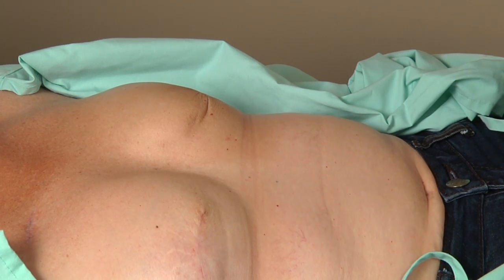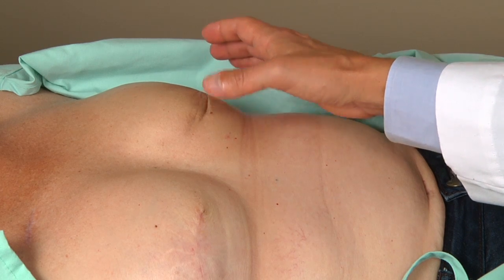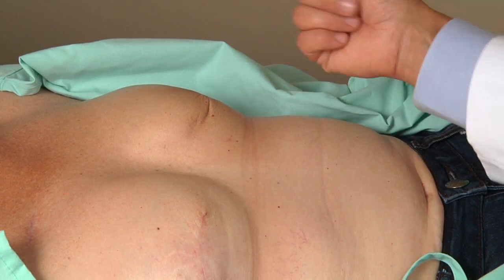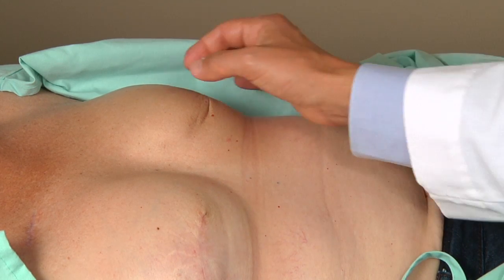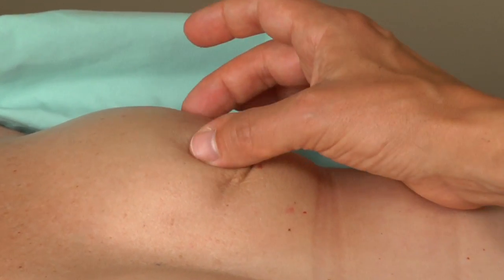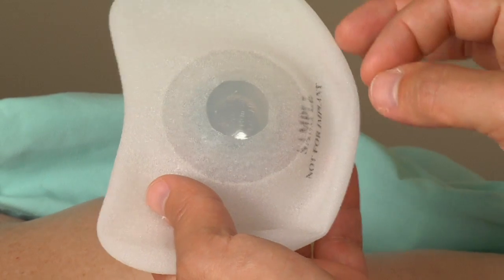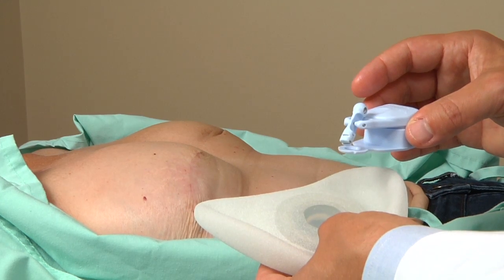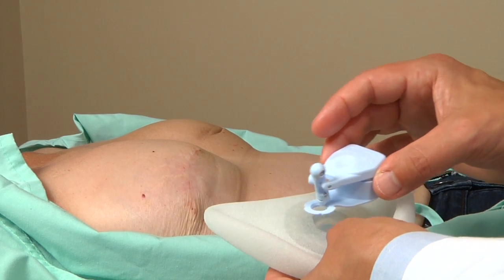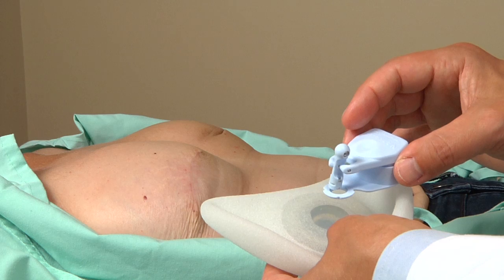This patient has had previous filling of her tissue expanders and we are now adding further volume to the left side, which is radiated and therefore tighter, needing to catch up to the other side. Often the fill port can be felt, corresponding to the firm area on the tissue expander. The Magna Finder has a toggle with a small magnet that finds the metal back plate, and when marking we do this in 90 degrees to localize the center of the fill port.